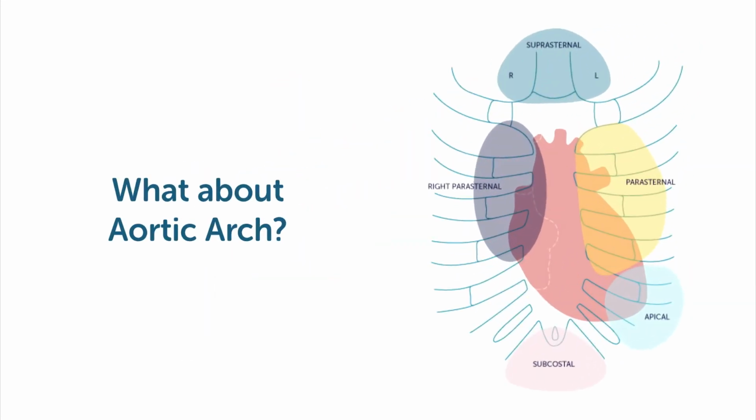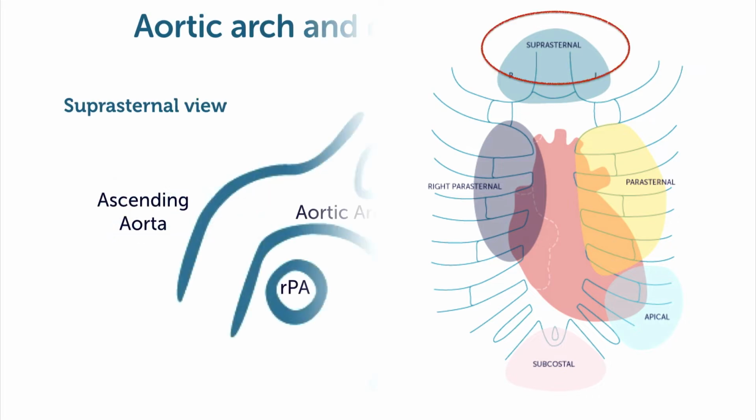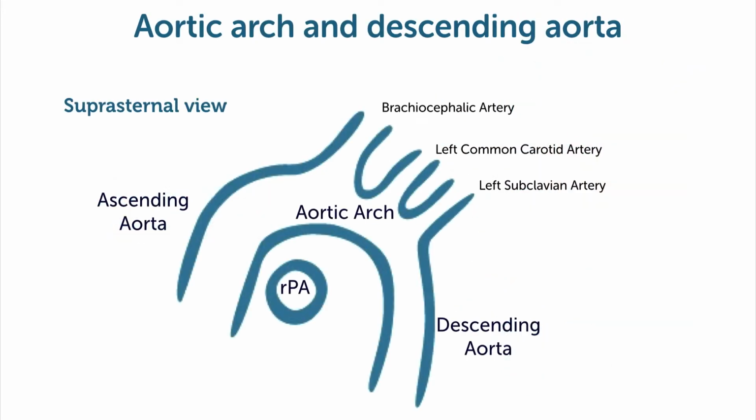For the aortic arch, you need to use a view that we learned in the chapter on aortic regurgitation, namely the suprasternal view. So we point the transducer downward towards the aorta, and that's where we'll see the aortic arch. Now, this is a view that works best in young individuals. In elderly patients, it's sometimes a little bit more difficult. But what you see is the aortic arch here with the ascending aorta and then the descending part. And here we can also measure. We would measure, for example, here or here, and sometimes we're even able to measure parts of the descending aorta.